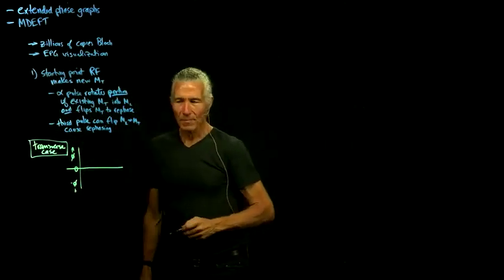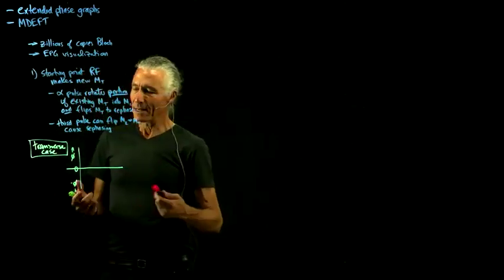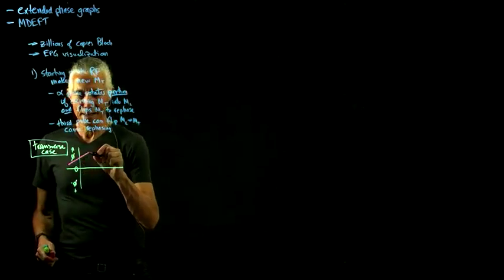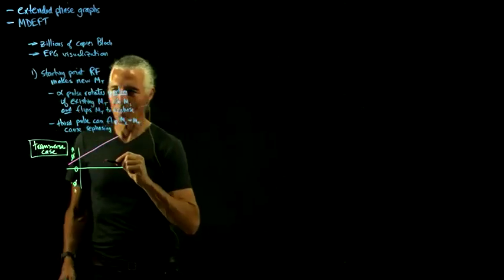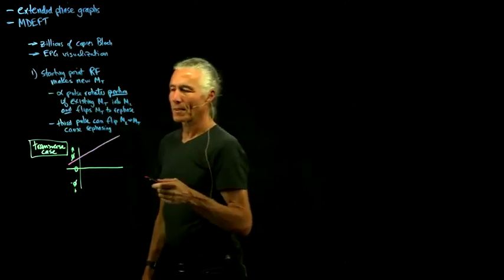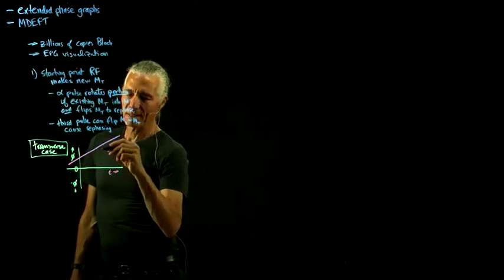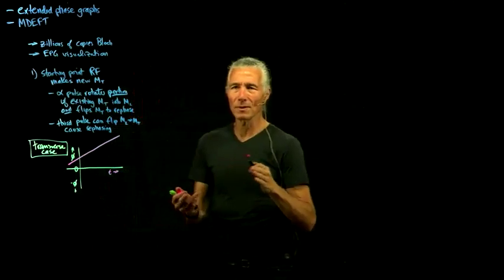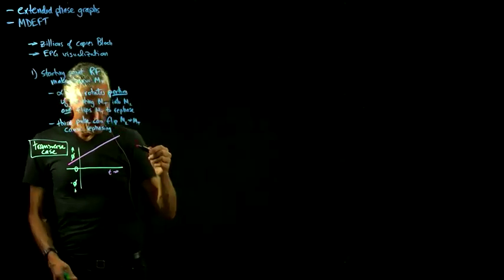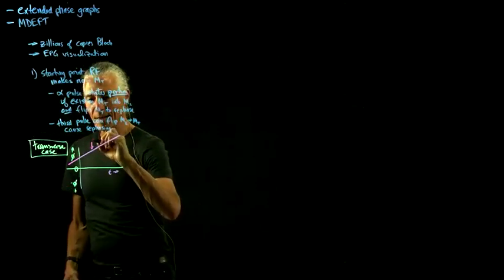So if we've got some transverse magnetization in our system, we draw a line to indicate that it is slowly getting out of phase more and more because of a gradient or because of B0. So over time, this is time, you just get more and more spread in the phase. And so now we apply an RF.